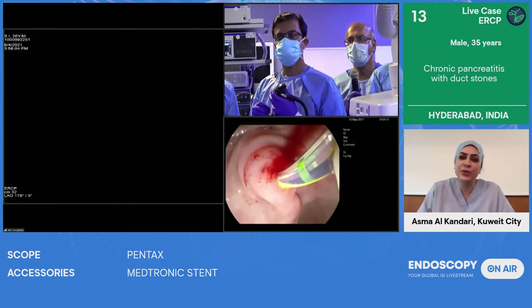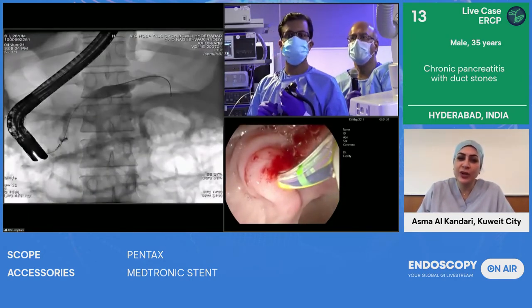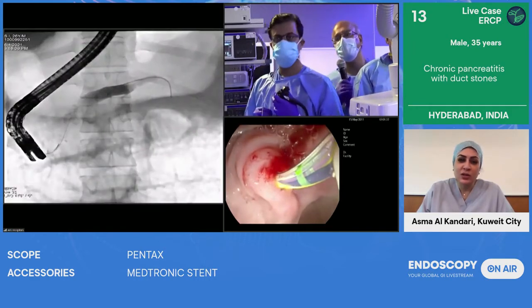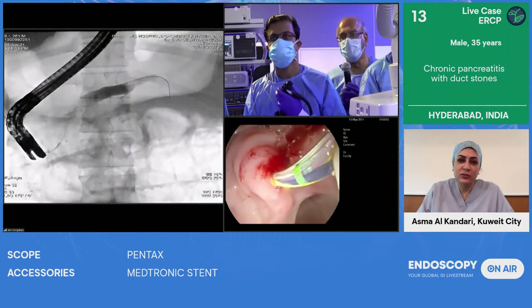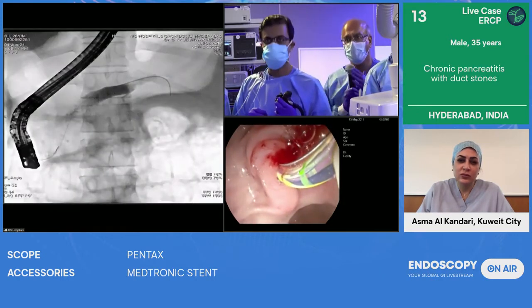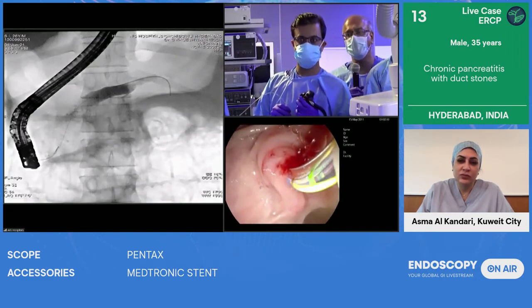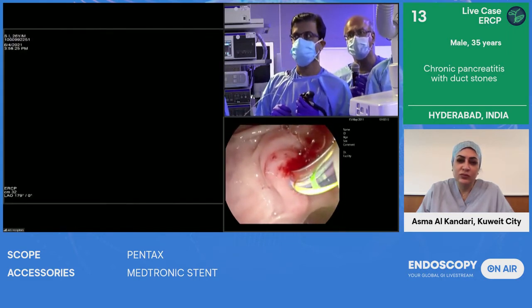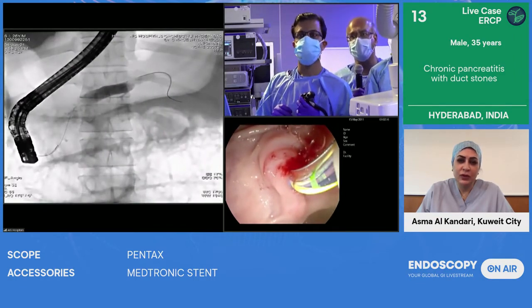Rakesh, how do you decide on the biodegradable stent? One lasts for weeks, one for days, one for 1 week. Which one are you going to use? Usually, if it's for prevention or prophylaxis for pancreatitis, we use the one which is only for 4 weeks, the short one. We also have an ultra short one for 10 days. But if it is for a longer period, as we want to use it as a stent for the particles to come off or for a stricture, then we use the longer version, minimum 3 months. So that's how we do.